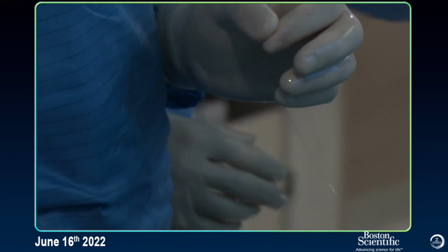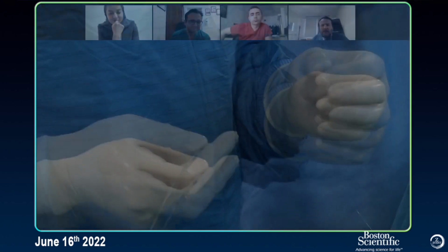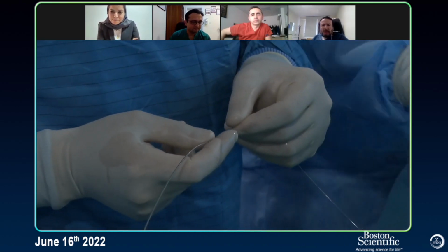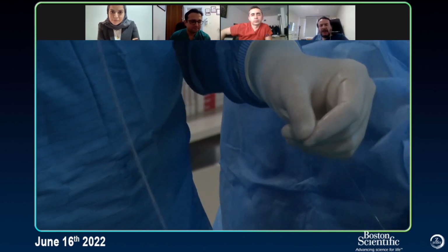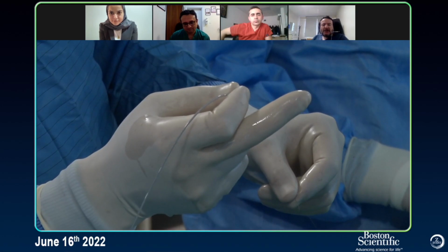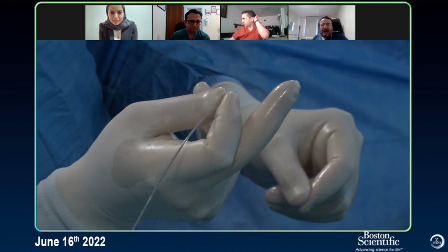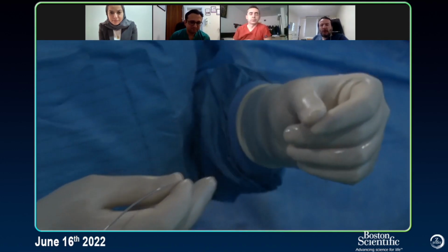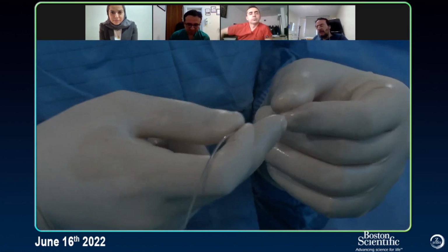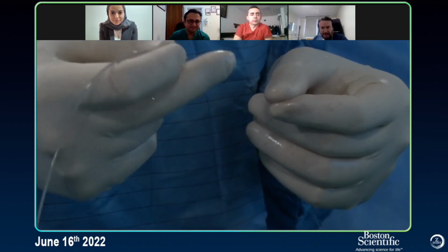And I don't know how helpful that is, but since then I haven't encountered any stuck wire in the rota. So I think it might be somewhat helpful. And propofol just 2 to 3 cc in the bag. And we should also be sure that the fluid is dripping very fast, because if you don't have the fluid dripping very fast, the wire gets stuck on the rotablator. So we should check that, and I have learned that from Esad. Thank you for that, Esad. Propofol would be a good solution. All right, I didn't use it anyway.